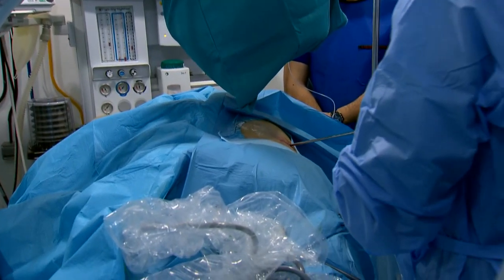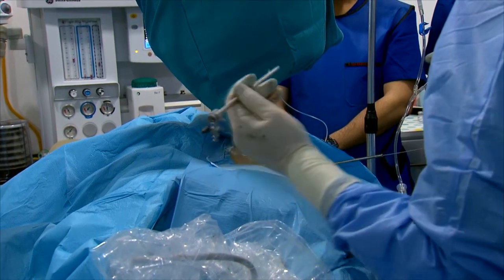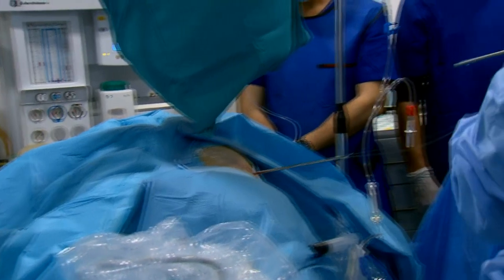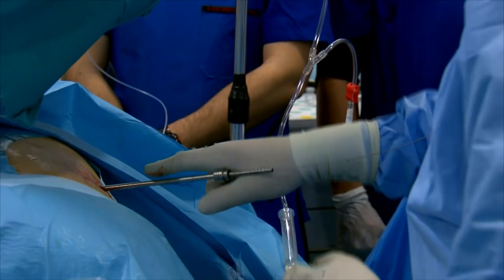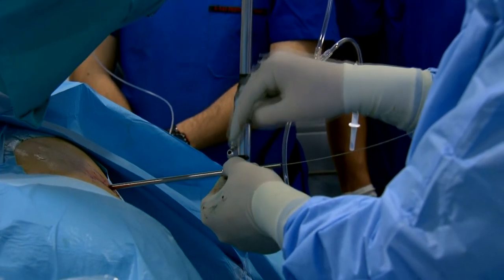Okay, now we take this Amplatz sheath. This is stainless steel, it is reusable, very durable, you can use it for years. This Amplatz sheath exactly fits the stainless steel dilator, like this. And what I do is, I put my right hand with the digital finger like this. And this is something like a hand grip.